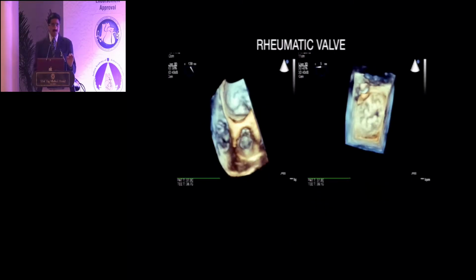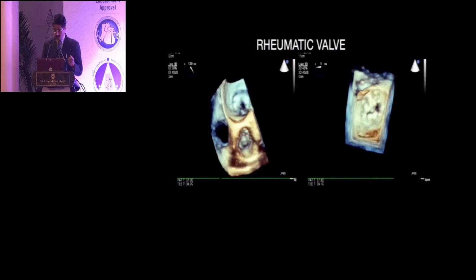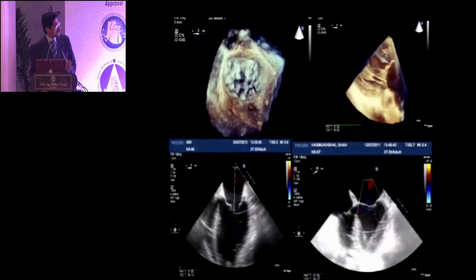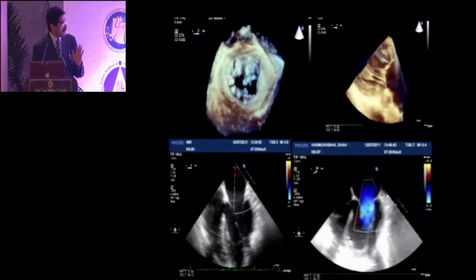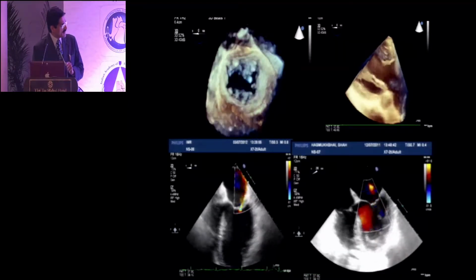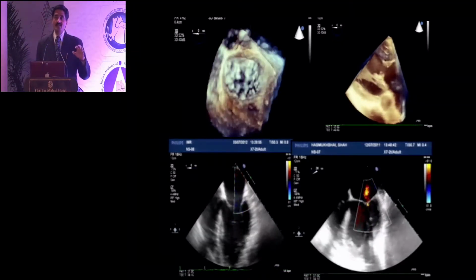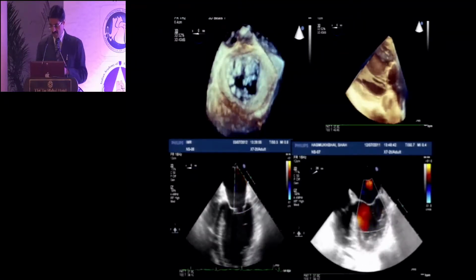But in rheumatic heart disease, there are still surgeons who manage to do the repair by open mitral commissurotomy. They put in a ring, or they cut the cords or replace the cords, but in that it is very important to assess both leaflets, whether they are calcified, and what the status of the commissures is. The last and important aspect is ischemic mitral valve disease, where usually we find normal leaflets. The important aspect is when we look at the cords, the posterior mitral leaflet is tethered in ischemic mitral valve disease, and this is the biggest difference in left ventricle geometry as compared to the other diseases.